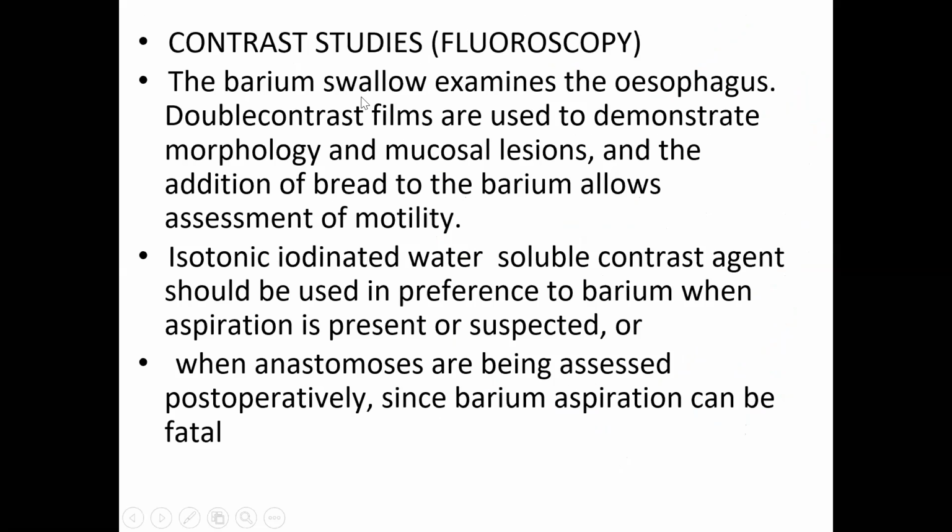Contrast studies for fluoroscopy. The barium swallow examines the esophagus. Double contrast films are used to demonstrate morphology and mucosal lesions, and the addition of bread to the barium allows assessment of motility. Isotonic iodinated water soluble contrast agent should be used in preference to barium when aspiration is present or suspected, or when anastomoses are being assessed post-operatively, since barium aspiration can be fatal.